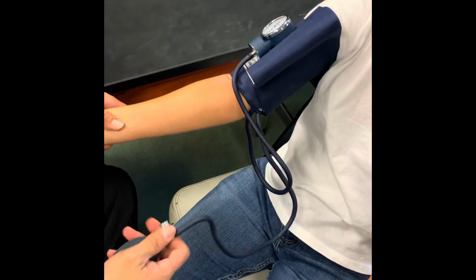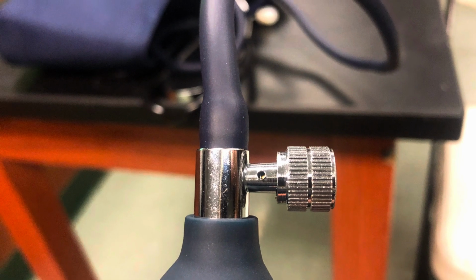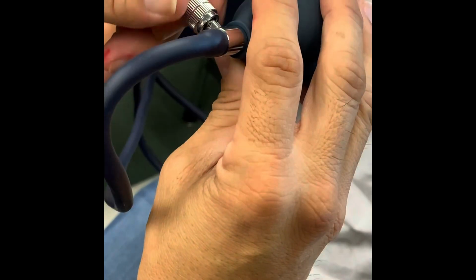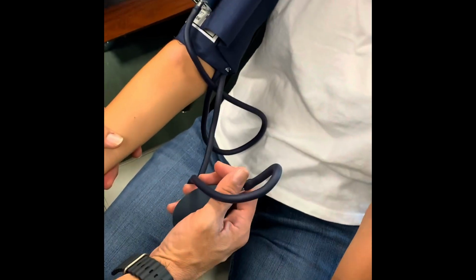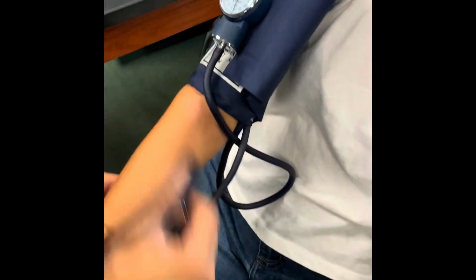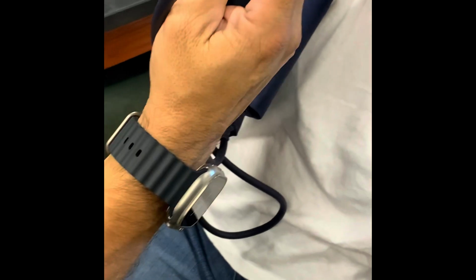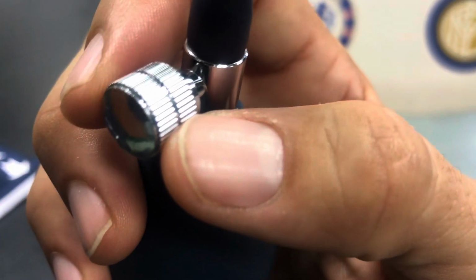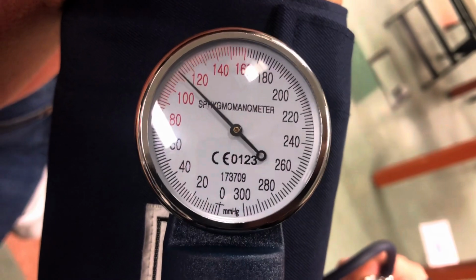Now, what you're gonna do to start is you're just going to practice inflating the cuff and then deflating it. So there's a little hole there, and that's where the air either escapes or doesn't. And so we're gonna turn the dial clockwise to cover the hole. And that will help it to inflate. And then when we want to deflate it, we're going to turn it counterclockwise. So you're going to inflate the cuff to 180 on the dial. And when you turn it to let the air out, it's not going to be a quick turn. It's going to be a very, very slow turn. And as you slowly turn it to let the air out, you'll see the dial slowly decrease to 0.